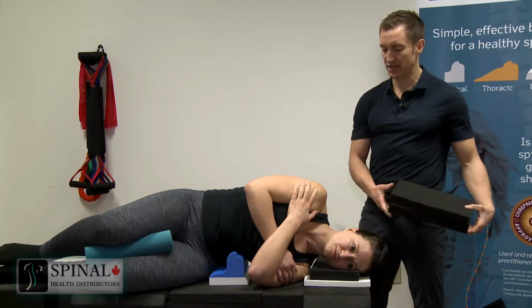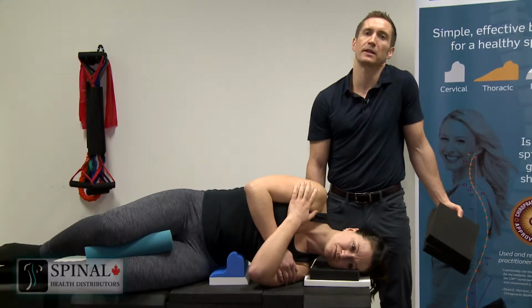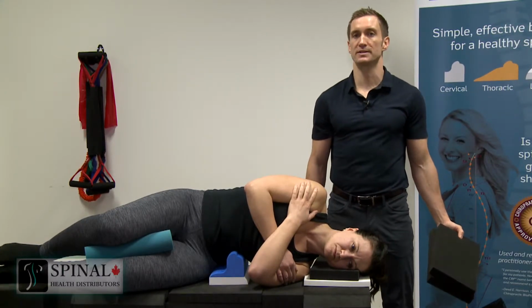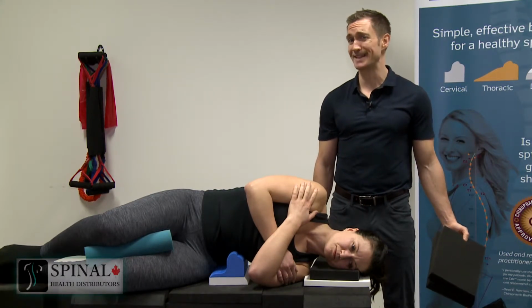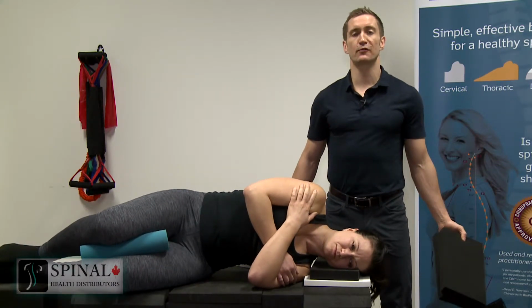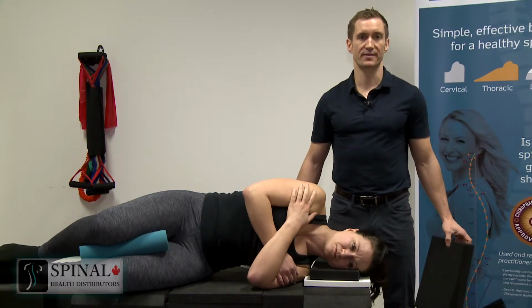Then the other thing to pay attention for is, a lot of times when patients lay on the roll, they're going to want to hike up that left shoulder. So that bottom shoulder, we want to keep in a fairly neutral position. Okay? When it's time to get off the Scoliroll, we have our patients lift their hips and slide the Scoliroll out, and they rest on the floor for a minute or two before getting up because the stretch can be quite aggressive.